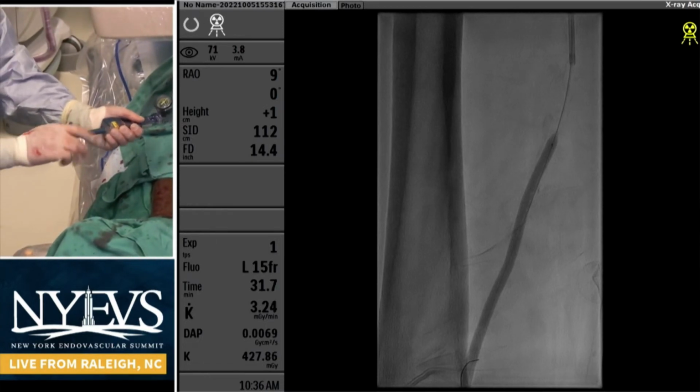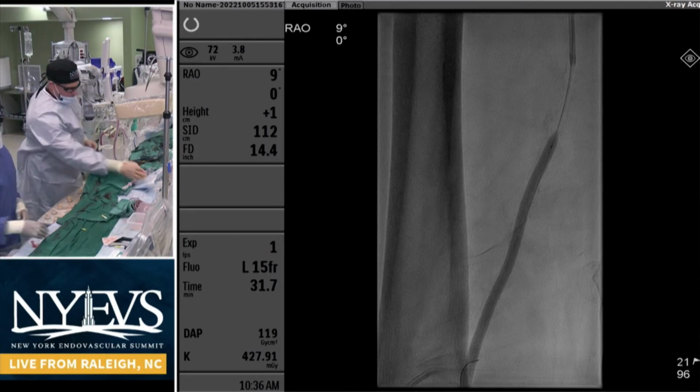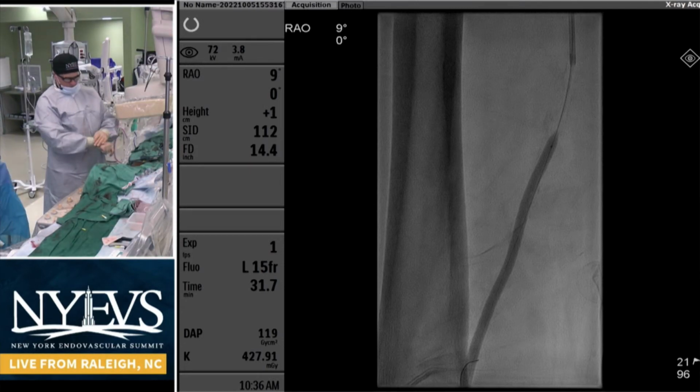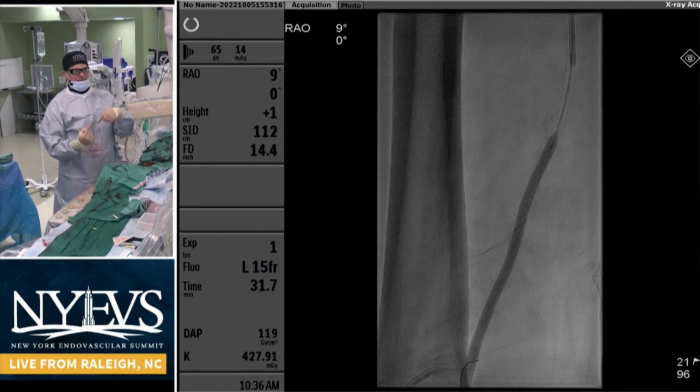So you want to tell the audience what did you do different? Like since we left you, what did you do? Anything special maneuver? Any change of wires? Any techniques that made you cross? Yeah, absolutely. So what we did is, again, we used a double balloon technique, fenestrated the lumen, such that now you got an open lumen between two planes.